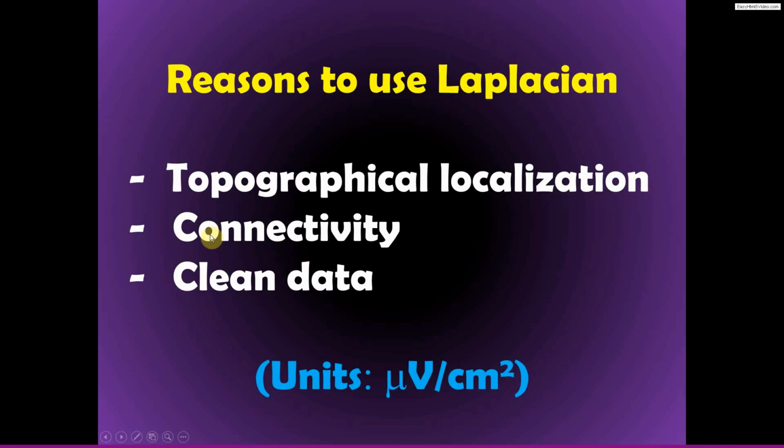Another motivation is to do connectivity analyses, which we will talk about more in the section on connectivity. And also just to clean the data. People are increasingly showing, and you might often see this in your own data, that simply applying the Laplacian will increase the signal-to-noise ratio of the results.